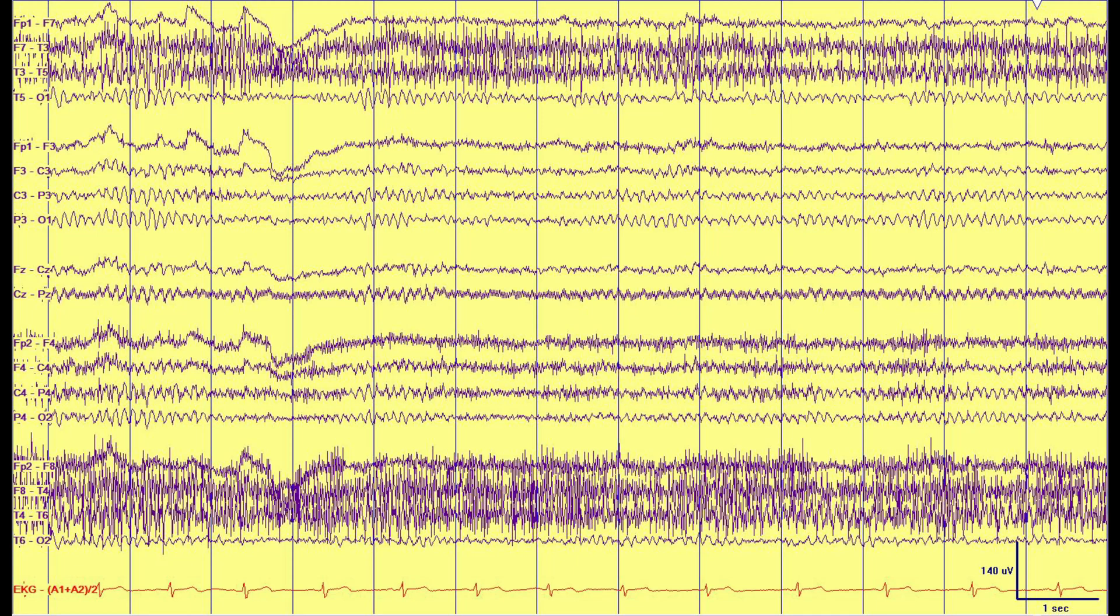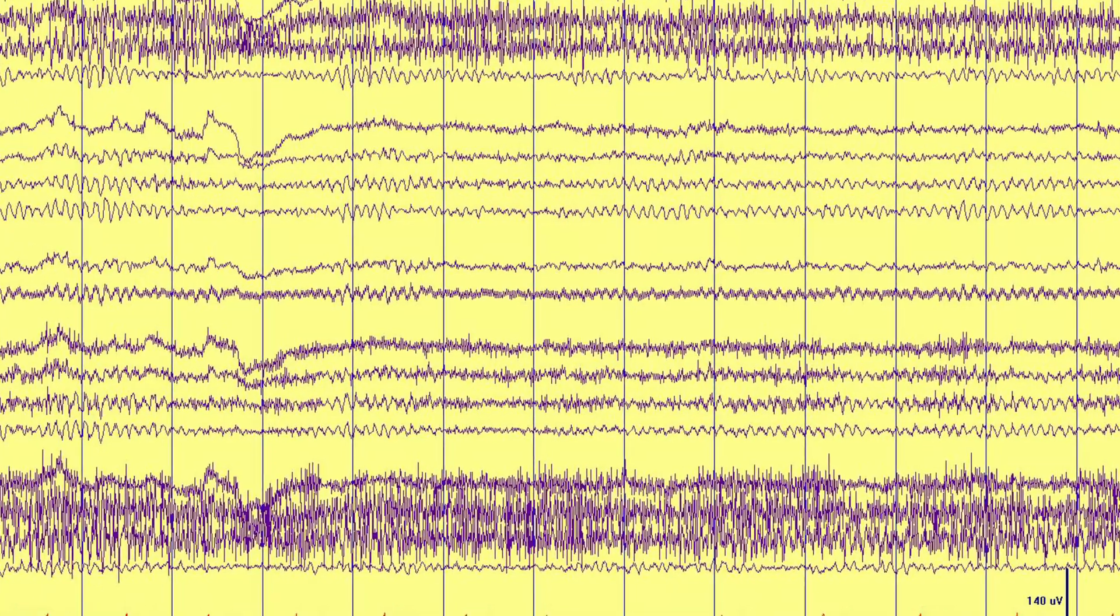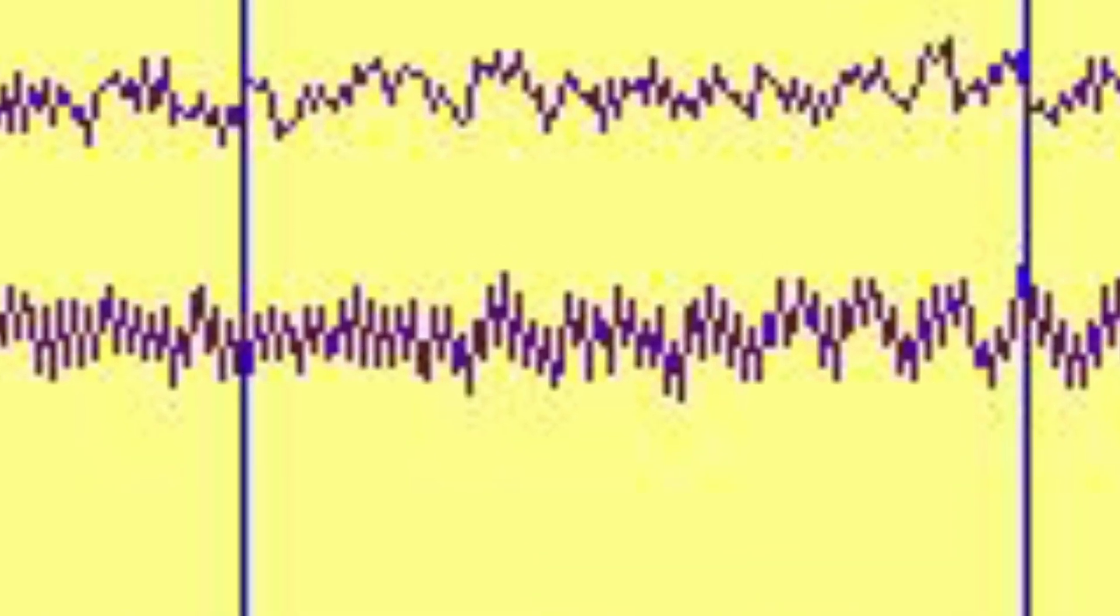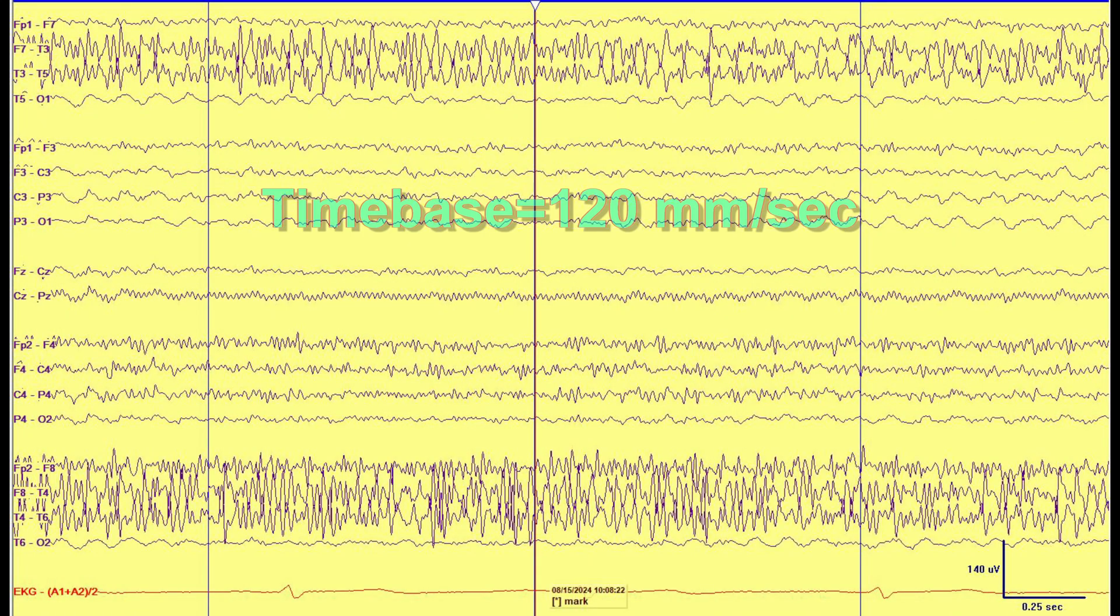In the United States it's 60. We're going to calculate this manually using the scale legend and a ruler. So let's zoom in. Now the time base is 120 millimeters per second. We're going to zoom in some more.